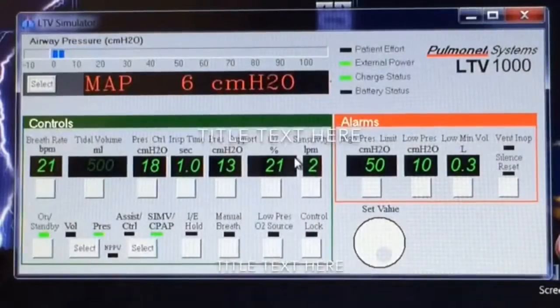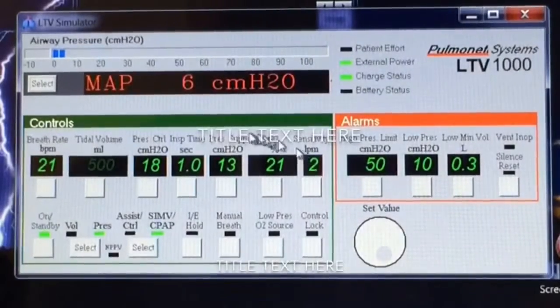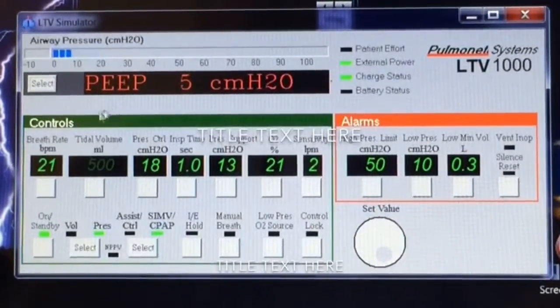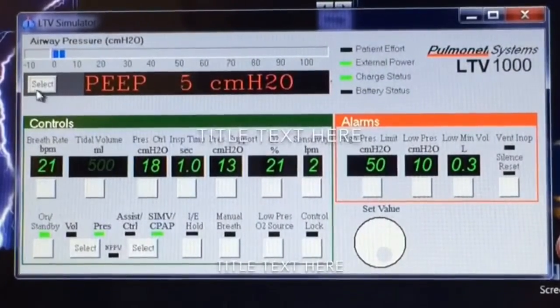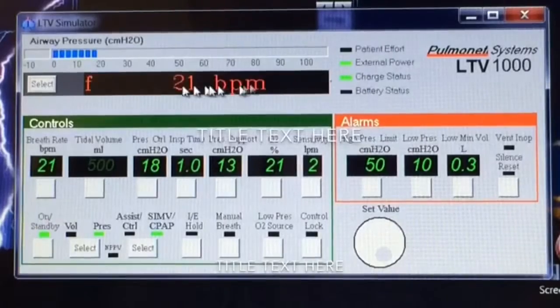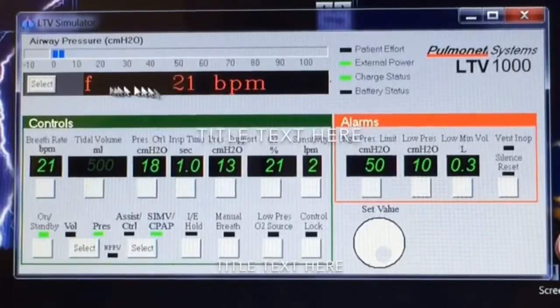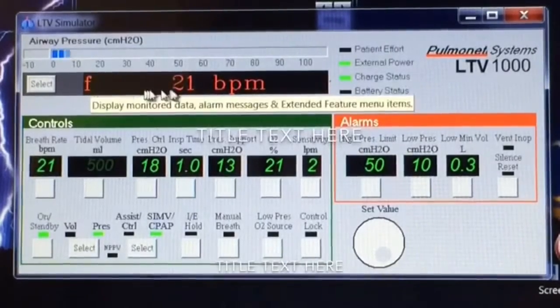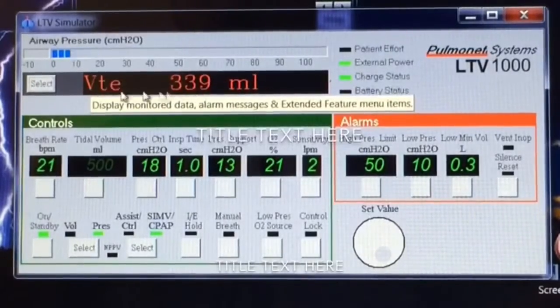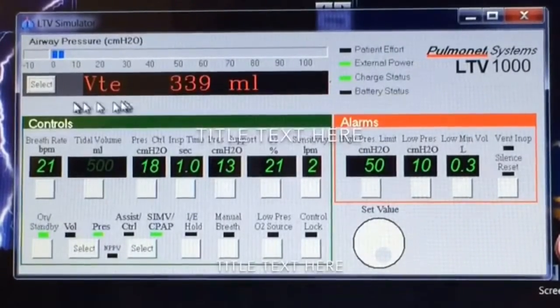Hello, it's Wes — Super Wes, that is. In this video, we're going to talk about the message bar up here and the different settings that scroll through there.